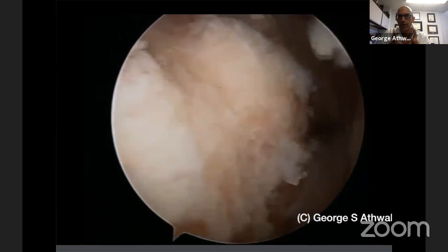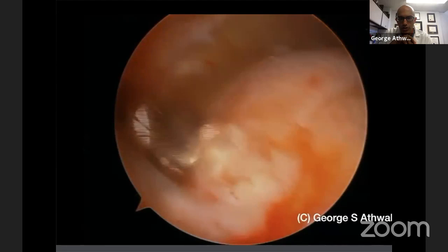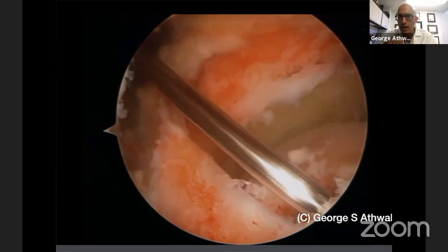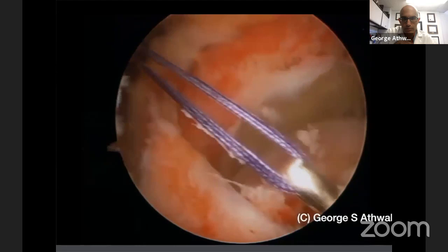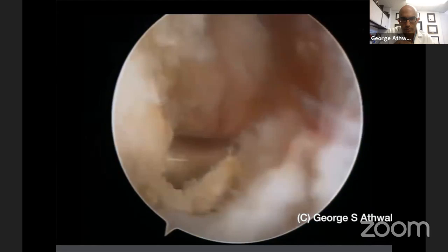And now I'm going to make my transosseous tunnel identical to how you would do an ACL reconstruction. So reamer, there's a larger reamer. So now I've got everything set up. And so now I'm gonna pass a number 2 Vicryl as my suture shuttle. Out, starting in the back, through the humerus, out the front, like so.